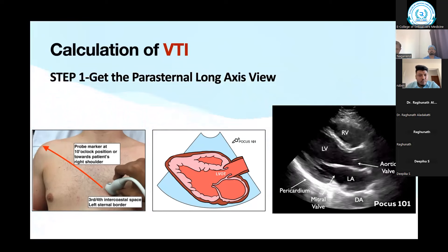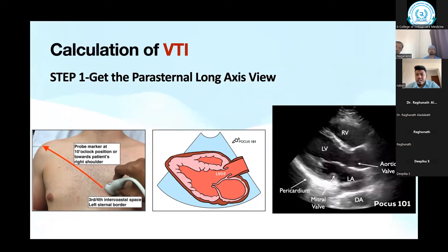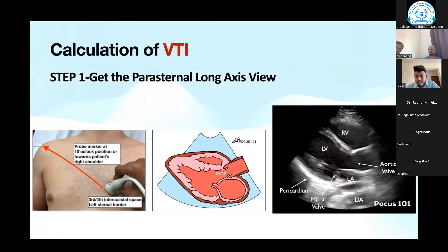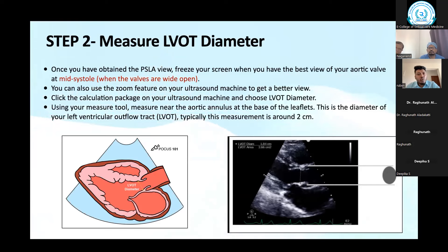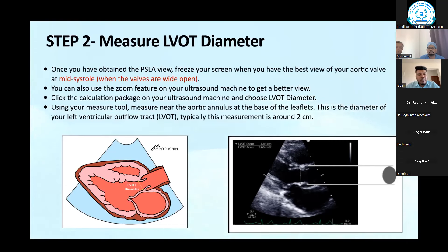Step two — measure the LVOT diameter. Very important: always measure the diameter when the valves are wide open, exactly at mid-systole. Measure from the aortic annulus at the base of the leaflet. The measurement is typically within two centimeters — usually less than 2 cm if there are no other valvular problems. Zoom the image on the ultrasound machine for a better view.